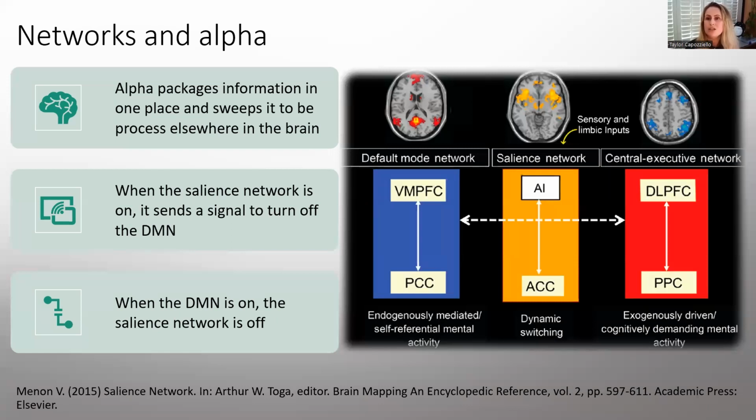So this is why we can do so much so quickly, because as we get information, it's processing it in the front and we're getting more information, and it just keeps coming in that way. So the default mode network is parietal by itself, PZ, then PZ to the left, then PZ to the right, then PZ to FZ to the front. And it's unidirectional.